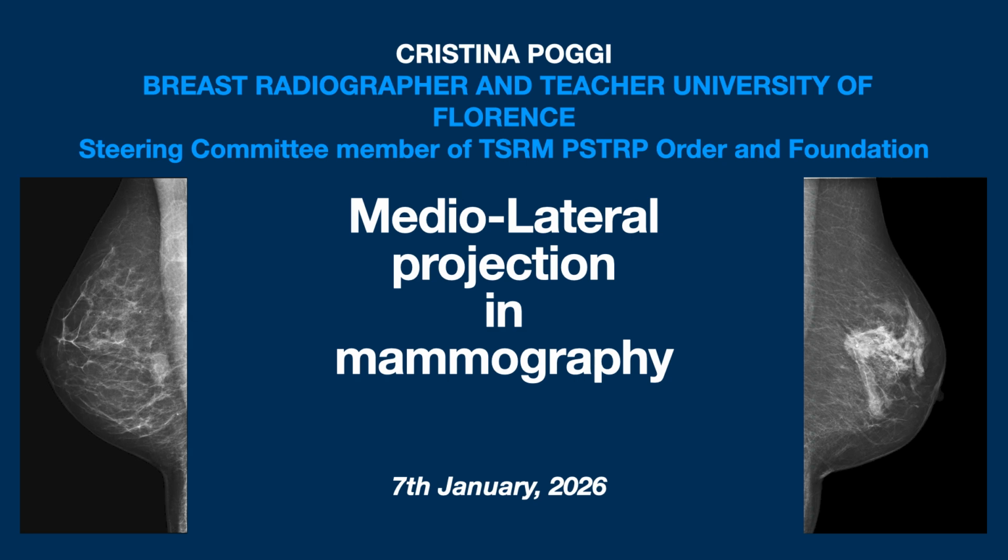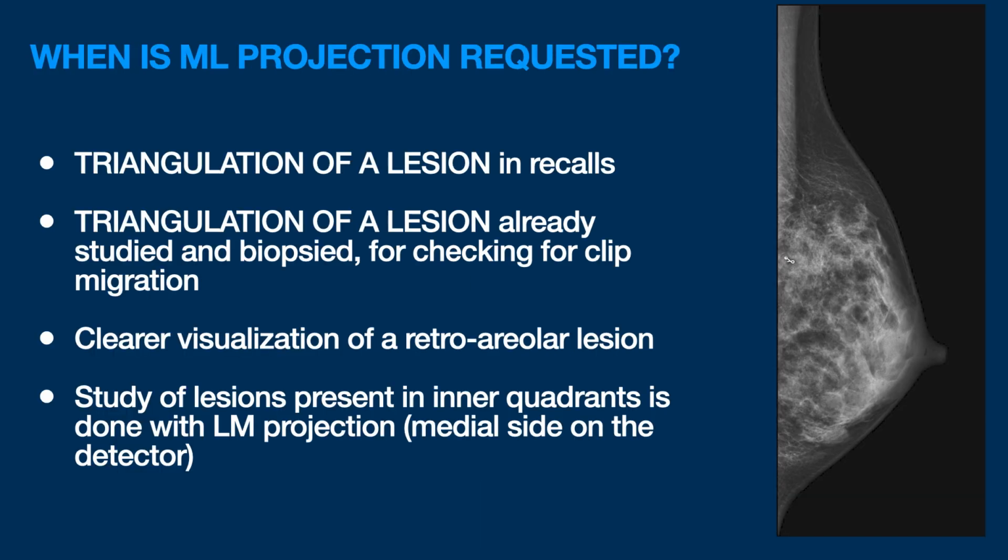Hello everyone, in today's video we will talk about medio-lateral projection in mammography. Why is this projection required?